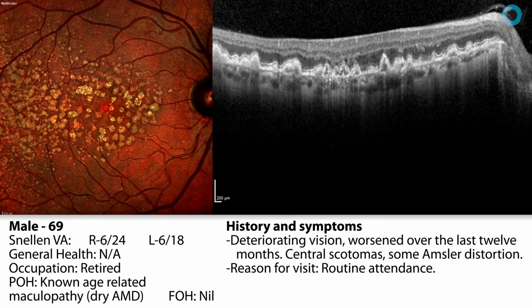In the fundus photo, I'm not sure if I'm looking at the choroidal vessels underneath, or I'm wondering if I'm missing any hemorrhaging anywhere, because I may well be, and I'm starting to suspect that this person may actually have wet AMD underlying. I'm not sure about that. Has anybody else got similar thoughts?